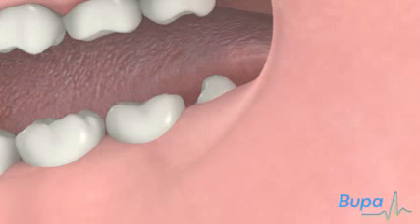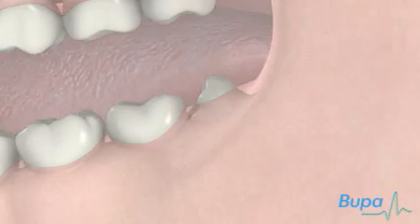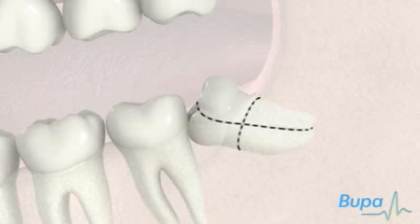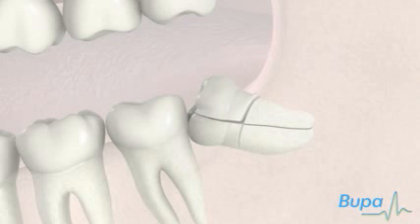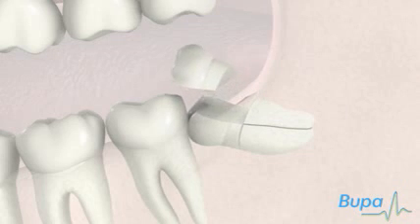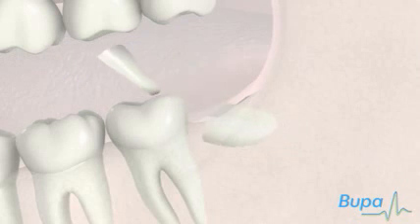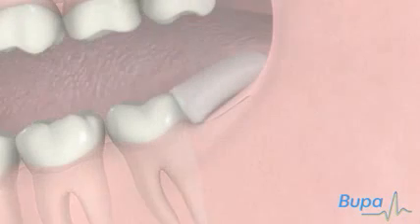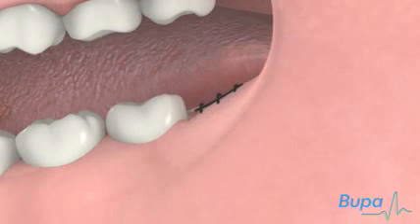Depending on the position of your wisdom tooth, your dentist may need to make a small cut in the gum over the tooth and then remove any bone that is covering it. The wisdom tooth is then taken out. Your dentist may need to cut the tooth into a few pieces to make it easier to remove. Your dentist will press a gauze pad against the gums after the tooth has been removed, and may use dissolvable stitches to reduce bleeding.